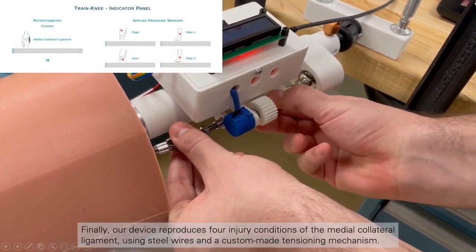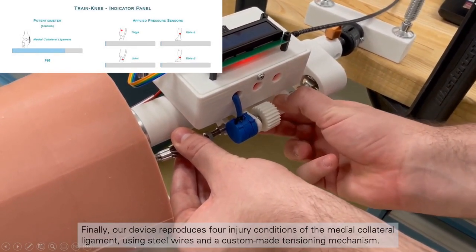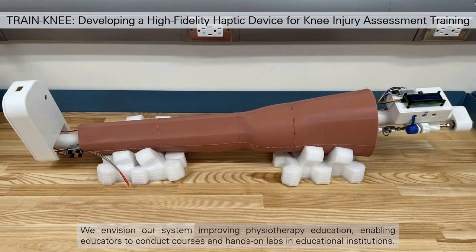Finally, our device reproduces four injury conditions of the medial collateral ligament, using steel wires and a custom-made tensioning mechanism. We envision our system improving physiotherapy education, enabling educators to conduct courses and hands-on labs in educational institutions.